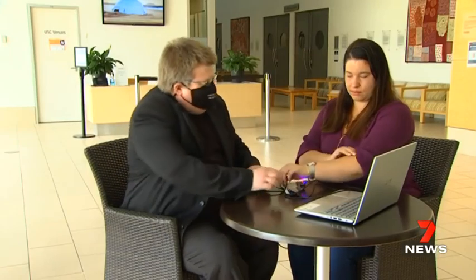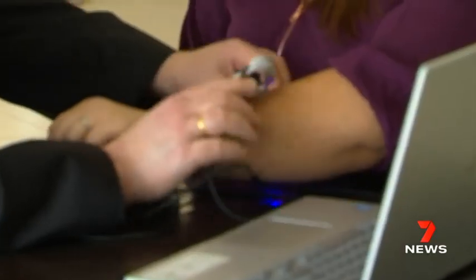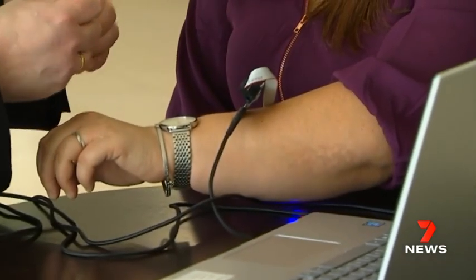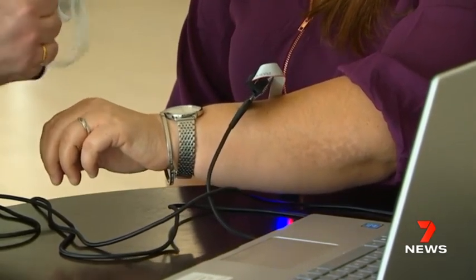So we started out trying to make a sensor that would improve brain-computer interfaces, so the kind of equipment that you'd see for people who don't have mobility and need something that they can operate just with their mind. But it's ended up that we've created something that really has a lot of applications in bionic limbs, as well as other areas where people need a really high accuracy and effective sensor that doesn't get affected by, say, the electrical fans in the house or something else.